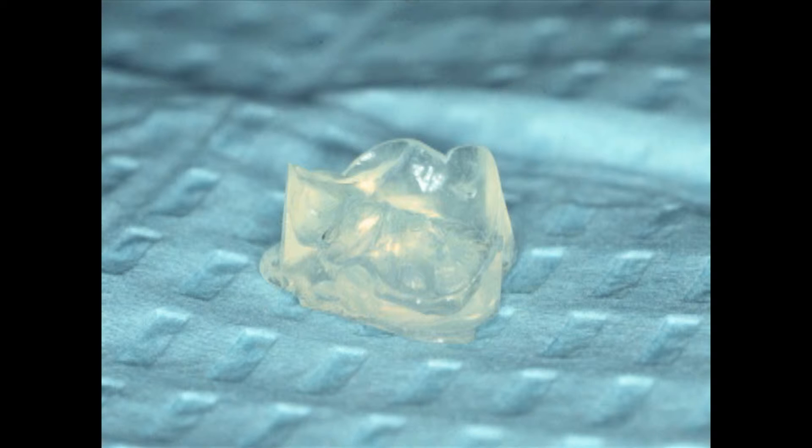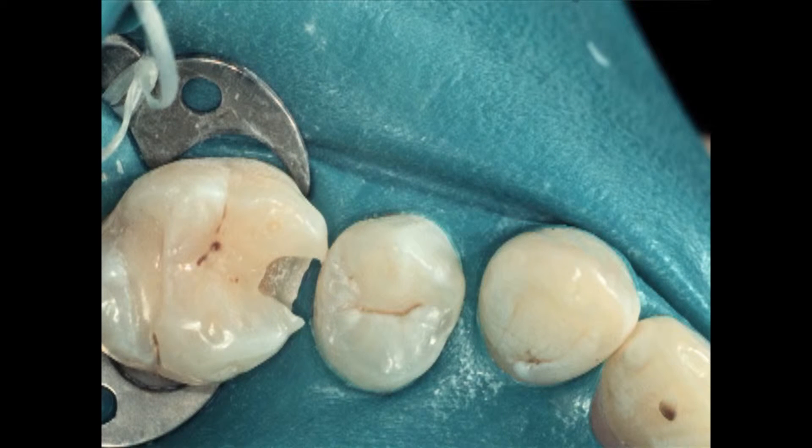A common question is: can I do this without putting the matrix band on first? You can, but the problem is that when you then use your matrix band, you have to trim the custom matrix to fit inside it — and you can't trim it absolutely perfectly. There'll be areas where it doesn't fit nicely, and in those areas you're going to get flash between your matrix band and your custom matrix.